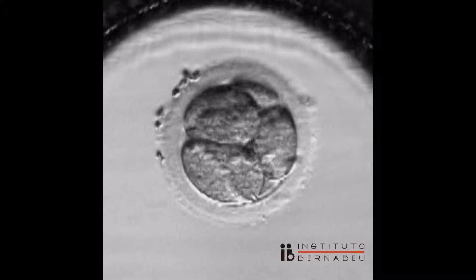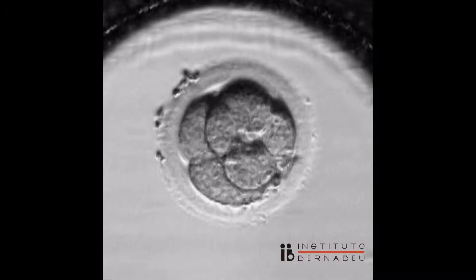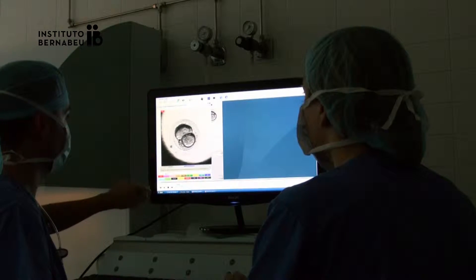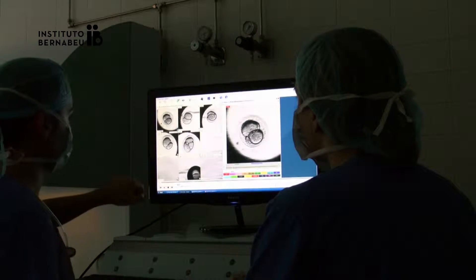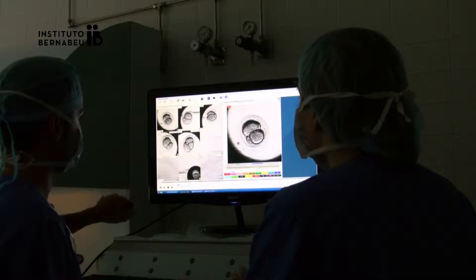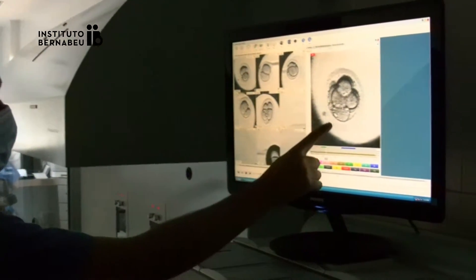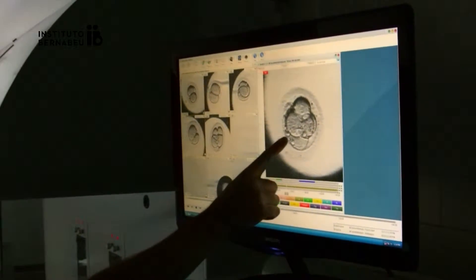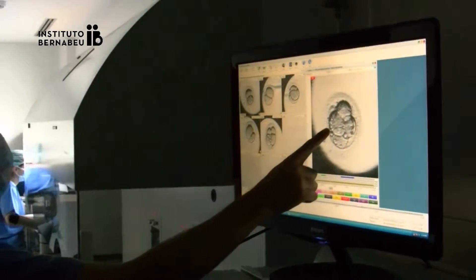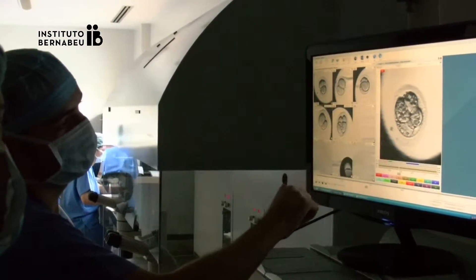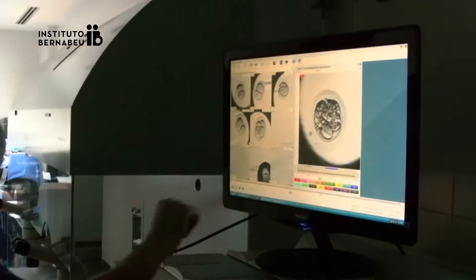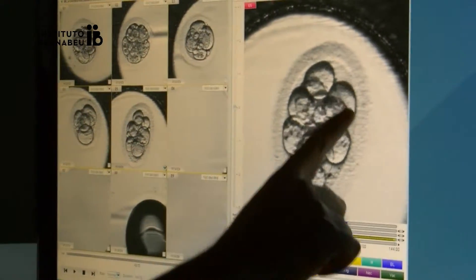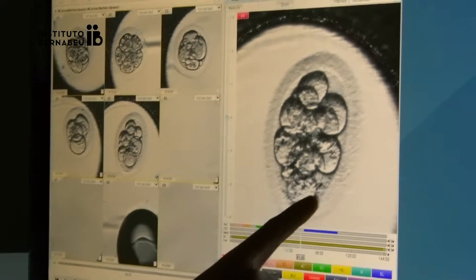Through this system, the embryos are continuously monitored and the images are obtained in 10-minute intervals. After each shot, the time-lapse system automatically disconnects to avoid prolonged exposure of the embryos to electromagnetic radiation.